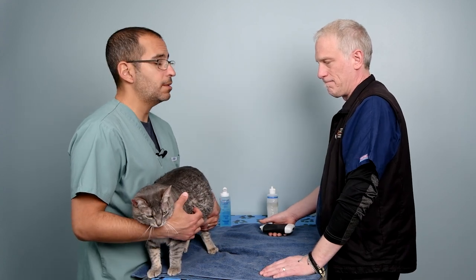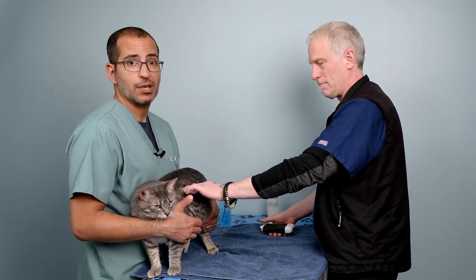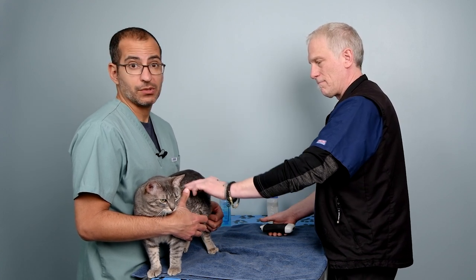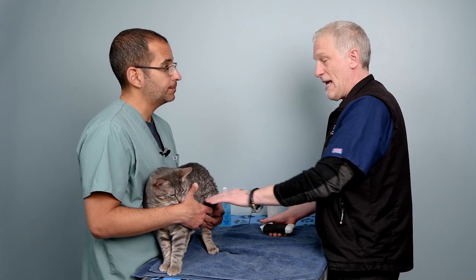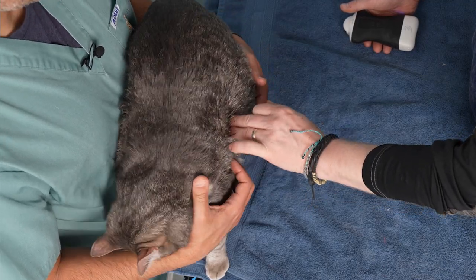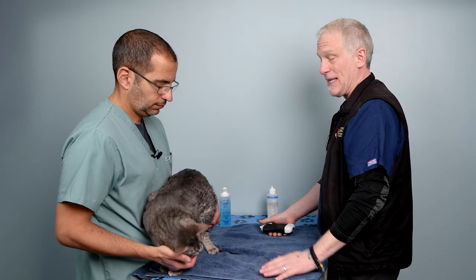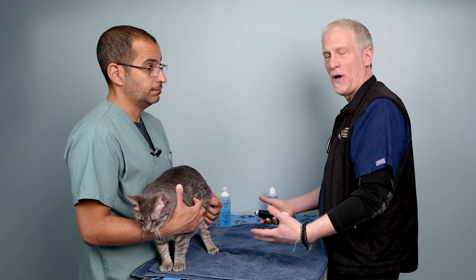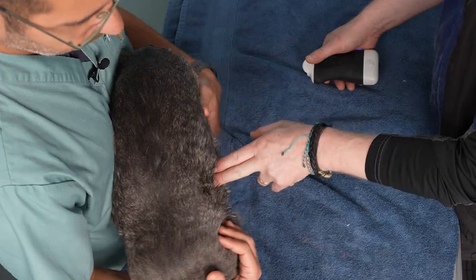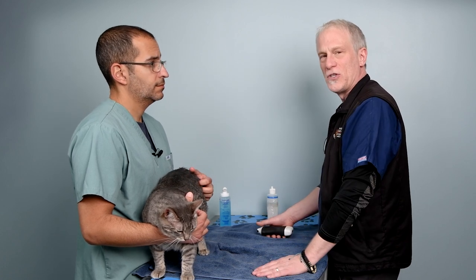Then we have our dorsal border. We're going to be finding these using ultrasound. The dorsal border is going to be the end of the pleural space and lung — we're going to get into the hypaxial muscles, and we'll know that pretty quickly. If we place our probe at that cranial border and slide straight caudal, at some point we're going to slide off lung and hit the abdomen. That's very difficult to predict and can vary depending on pathology, breed, and species. So we really like to use our borders: start over lung behind the front limb and slide caudal until you see the vertical edge artifact, which is the curtain sign transitioning from the lung onto soft tissues of the abdomen.